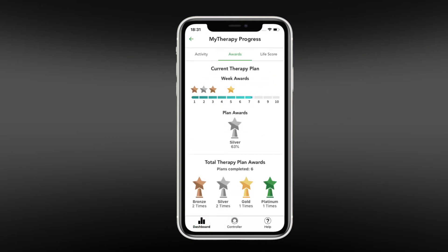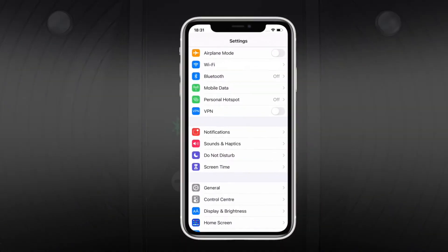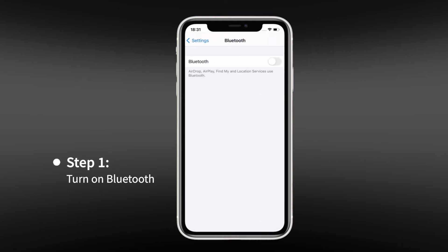Before starting, please make sure your device is fully charged or plugged into an electrical socket. First, turn your phone's Bluetooth on in order to pair your device with your phone. On your phone, go to Settings, Bluetooth, and turn on Bluetooth.